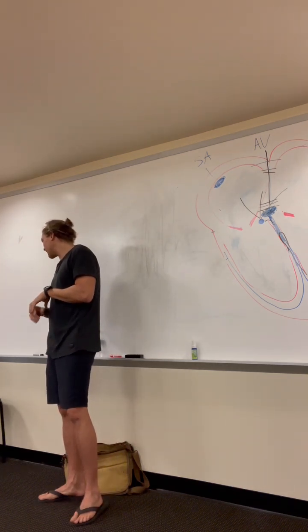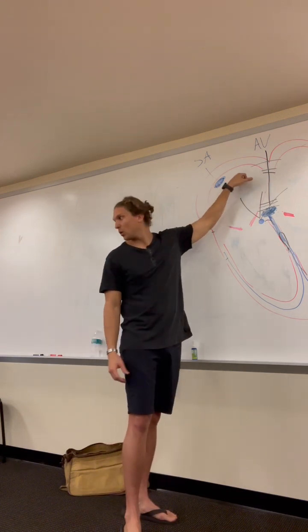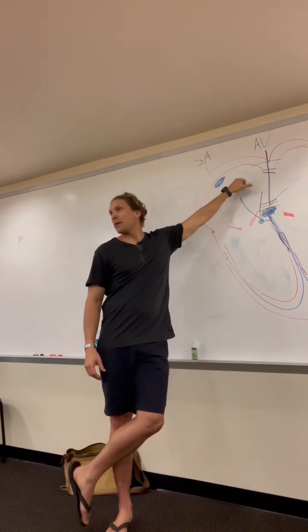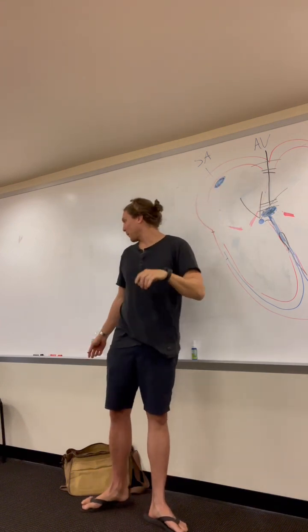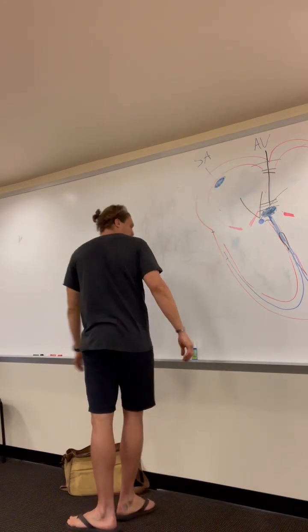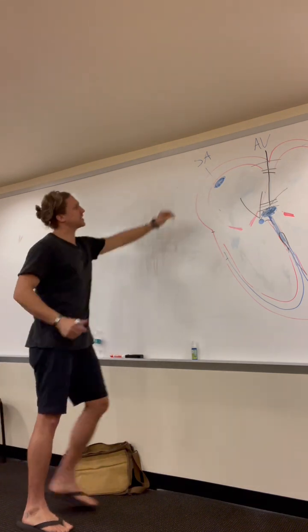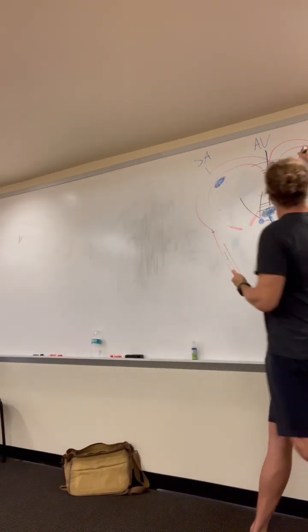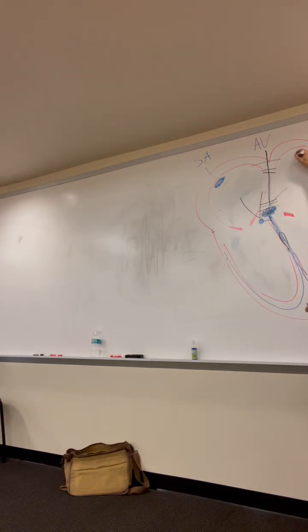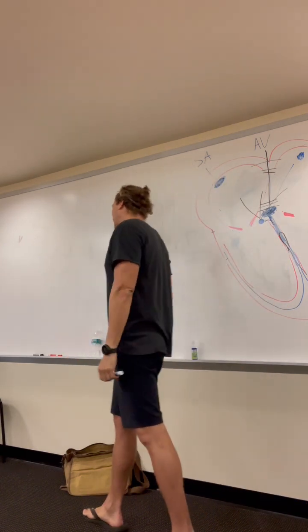All right, next one is a premature atrial contraction. I guess we're back where we started, huh? All right, so in a premature atrial contraction, your irritable focus is up in the top. So your SA node beats, sends a normal heartbeat down, and then this guy over here says, oh, I want to do that, and then this one starts a heartbeat, okay? It happens faster than it was supposed to happen, okay?